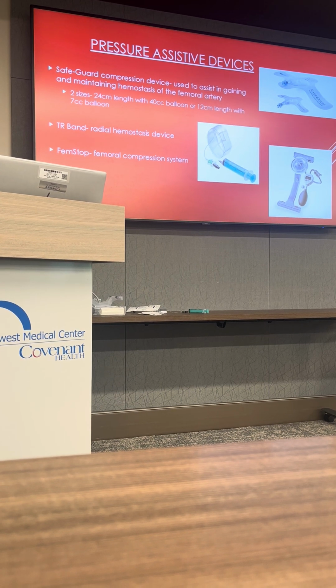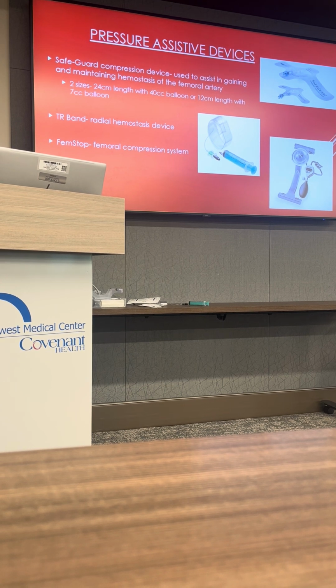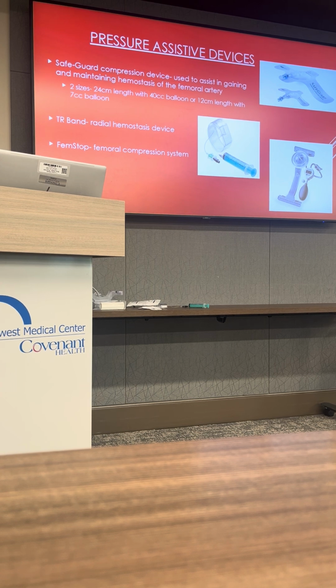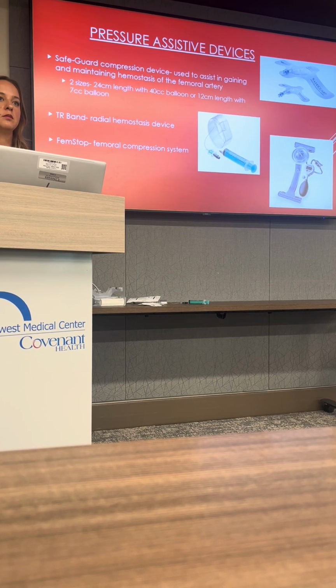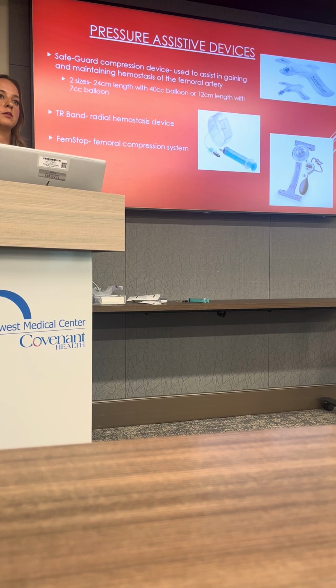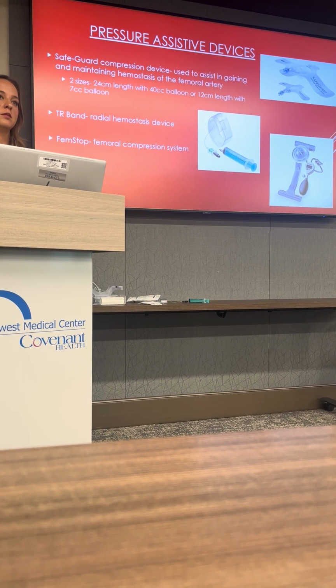Yeah. Do you use safeguard? You don't use safeguard, do you? I don't love them because I think it gives the nursing the wrong impression. Safeguards are technically under the umbrella of a compression device, but I use safeguards a lot because for large bore access, we make a skin nick, and as you all know, you can have capillary bleeding from the nick site. That's really where the safeguard started to be used at Park West, when we put Impellas in, or 12 French sheaths, and you had a little bit of oozing from the skin nick, not necessarily arterial bleeding.